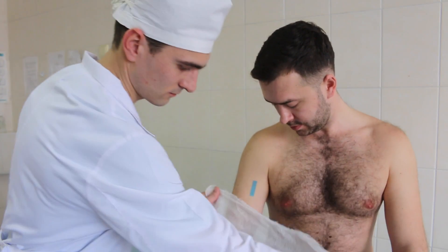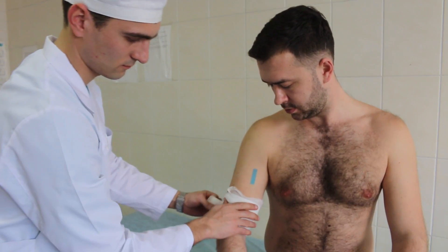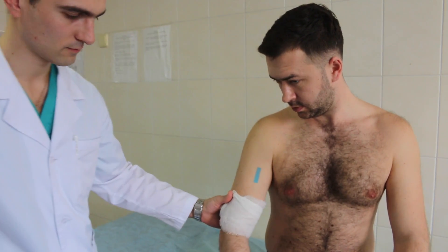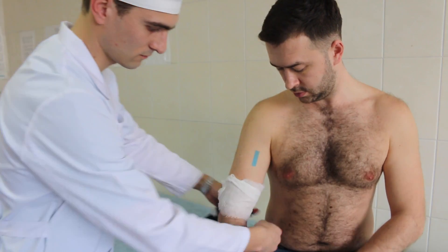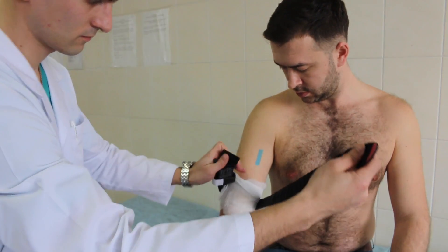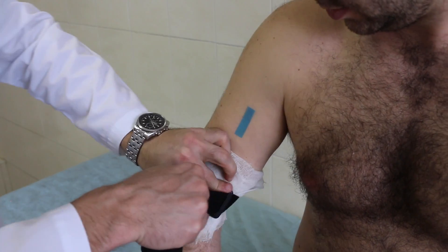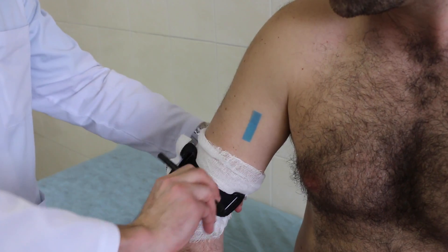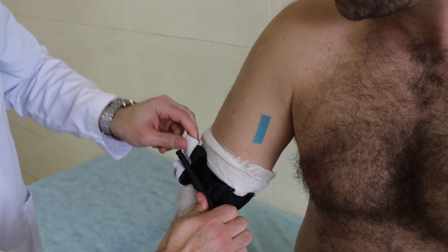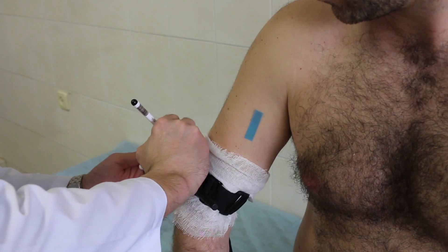In case of venous bleeding, you should apply the tourniquet 2 inches distal to the wound. The procedure of tourniquet application is the same as described earlier. After tourniquet application, wash the wound with antiseptic solution and dress it with a bandage. Finally, provide warmth and hydration and give painkillers to the victim. Do not cover the tourniquet once applied — leave it in full view for medical personnel when they arrive.